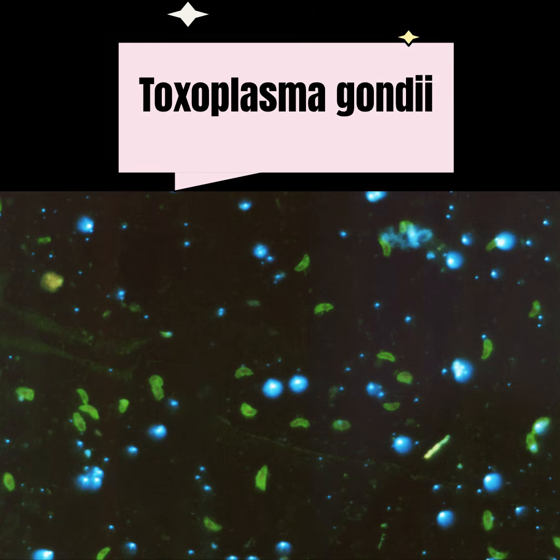If specific antibodies are present, they will bind to the surface antigens of the tachyzoites. In this specific image, the yellow-green fluorescence appearing around the periphery of the crescentic organisms indicates the binding of fluorescein isothiocyanate conjugated antihuman globulin to the primary antibodies that have successfully complexed with the tachyzoite surface.